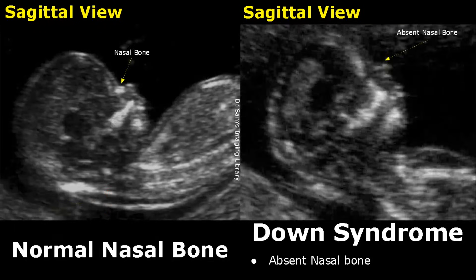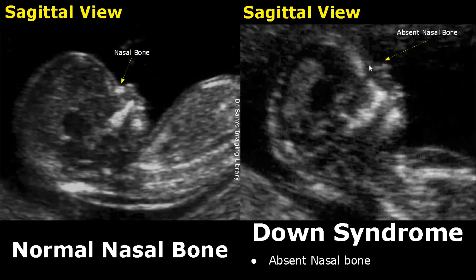In this image we see a normal nasal bone — this hyperechoic bone right here. And in this image we have an absent nasal bone; we do not see a hyperechoic bone. This is another soft marker for Down syndrome.